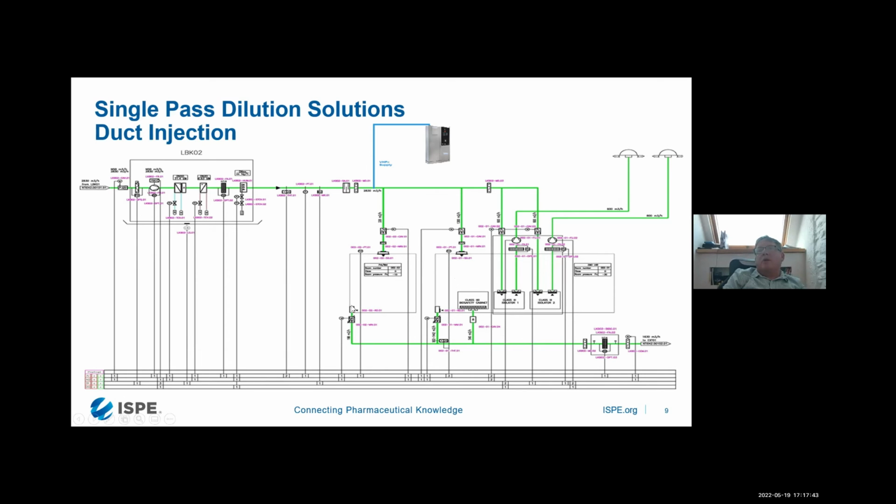very good installation because we have the extract placed on the lowest side of the room. But unfortunately, in many BSL labs, we see the HVAC on the top, but also the exhaust. In the pharma industry, it's always like this. Now in BSL, it's, let's say, more than 50% on the ceiling, which is easier for the guy to manufacture the rooms.